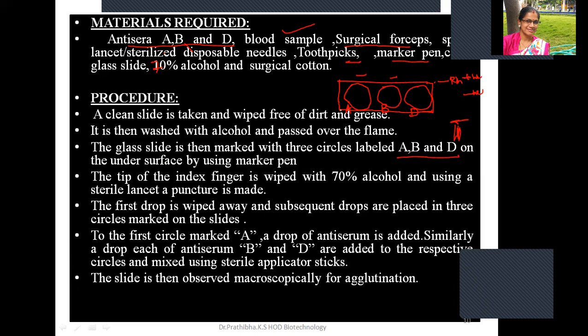What marking color ink have you used? That also mixes with the blood. That's why you always need to draw this circle and write A, B, D. You need to write from the bottom of the slide.